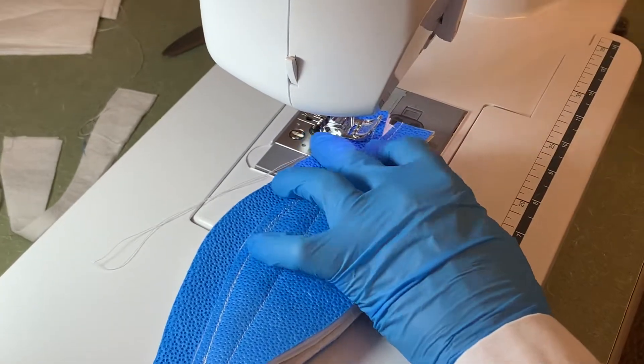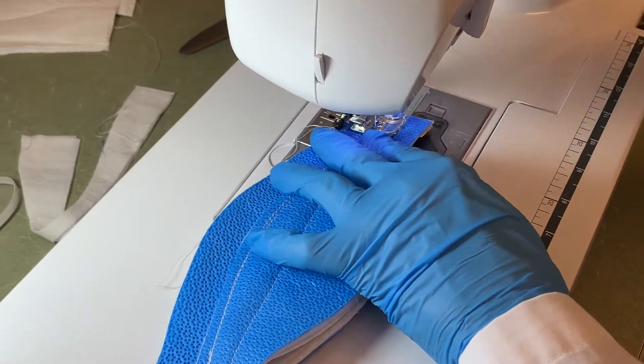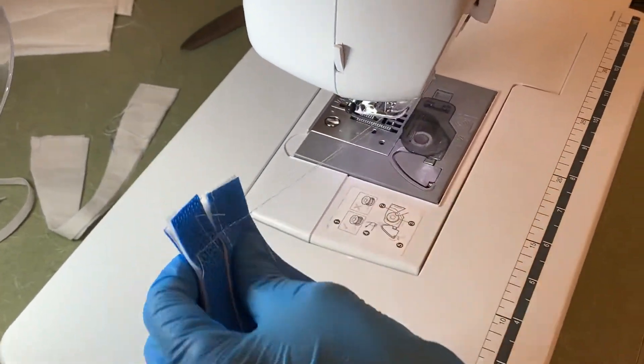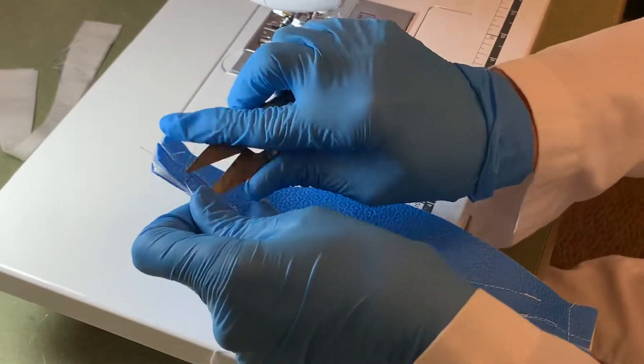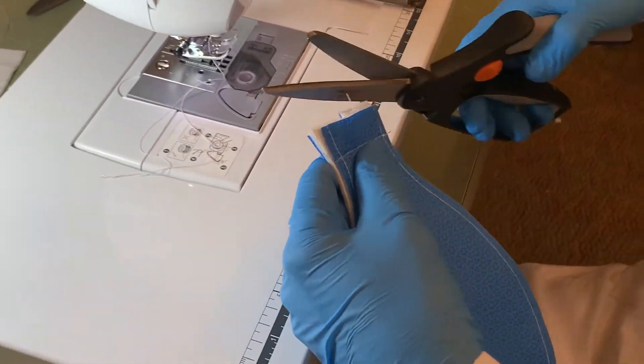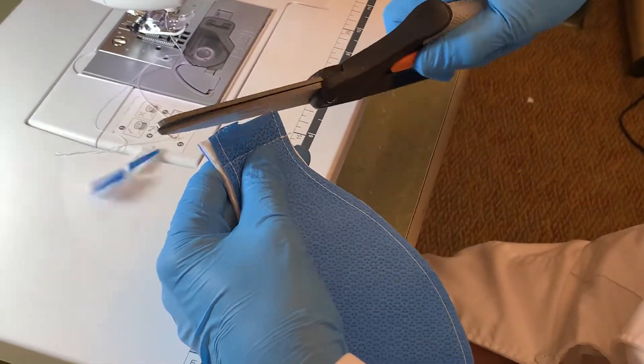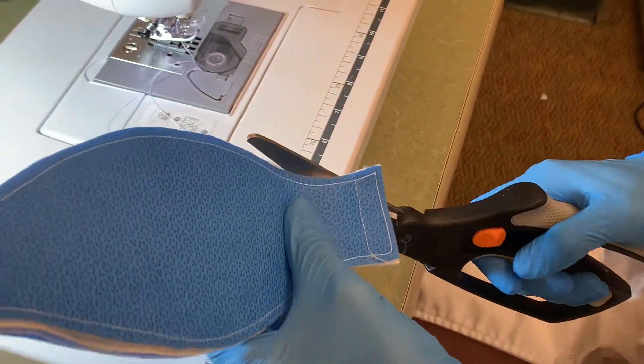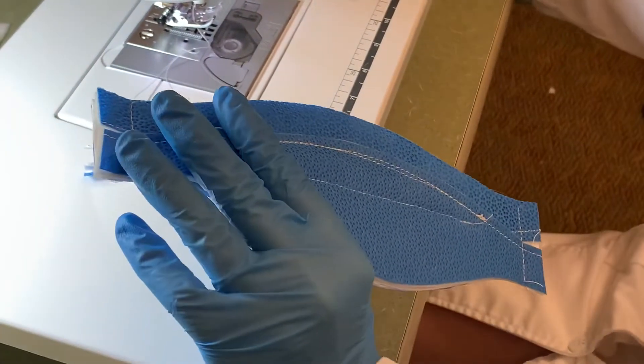Again, sewing at a half inch. Okay, now I'm just going to trim off this excess bit here. And I've got a little excess right here that I'm going to trim off. Just so the edges line up.